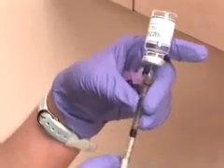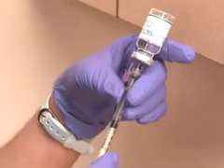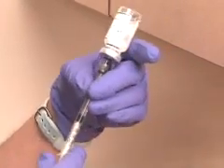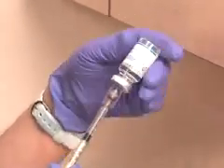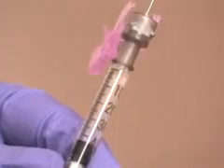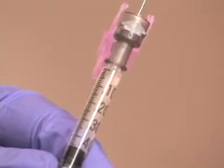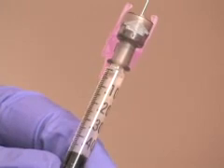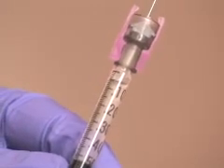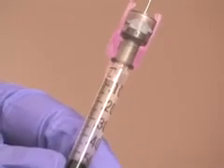Inspect the syringe for air bubbles, tap to release and re-inject them if necessary, then withdraw more medication if needed. Remove the needle from the vial. For a Z-track injection, draw an additional 0.2 to 0.4 milliliters of air along with the medication. The additional air will allow the medication to fully clear the needle and enter the muscle tissue.